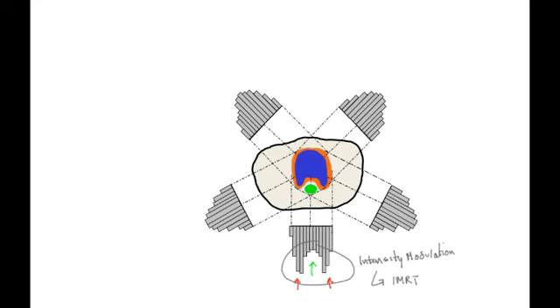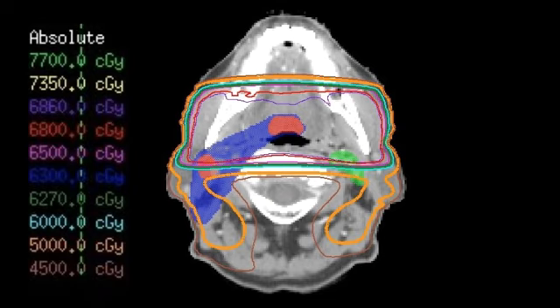So we looked then at this simple cartoon case of a prostate plan. Let's look at another case, a more realistic case, the classic example of where IMRT is used, in head and neck cancer. So here's an image. This is from a 3D conformal plan, not IMRT. Now you're trying to treat the disease to different dose levels. So the red disease is gross disease. You want to treat that to 6,800 centigray, ideally. An intermediate dose region, the blue region, let's say to 6,000 centigray. And then the green nodal region, you want that to go to 5,000.